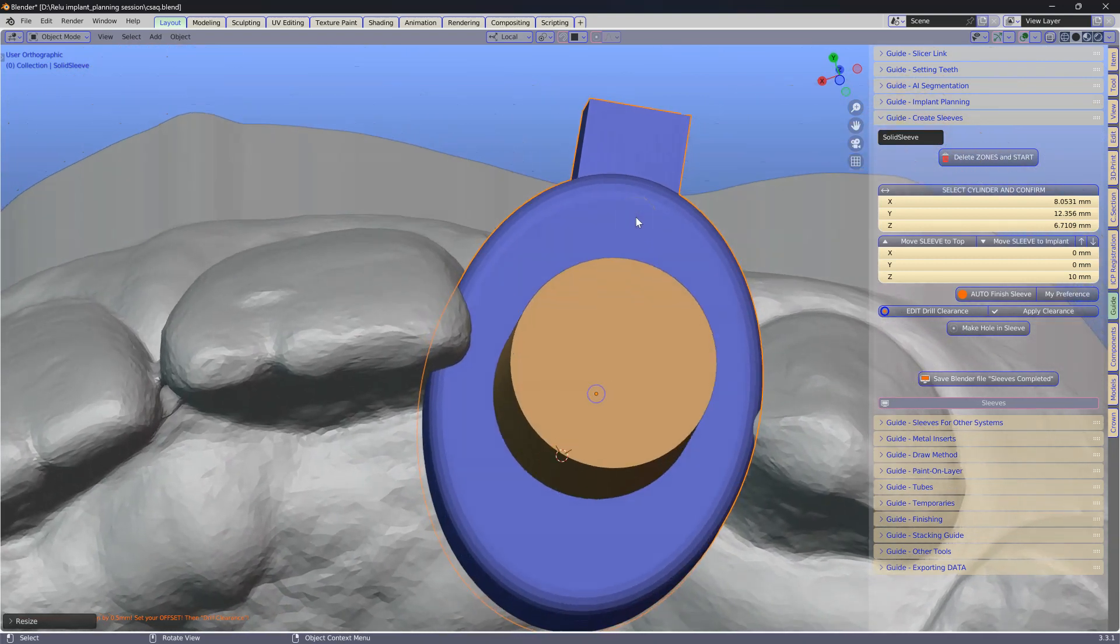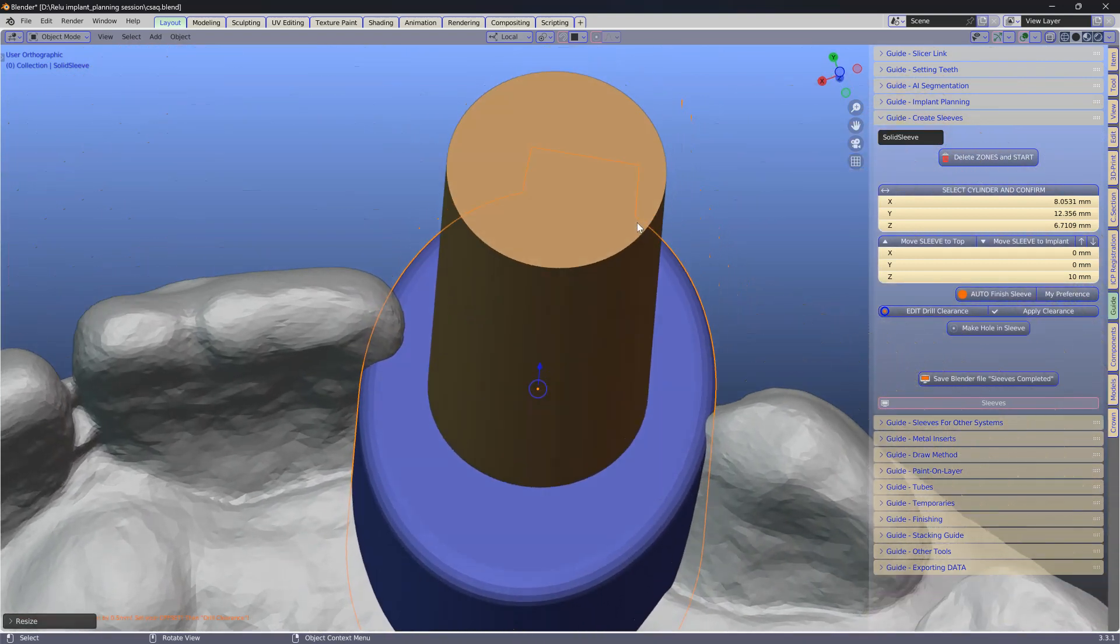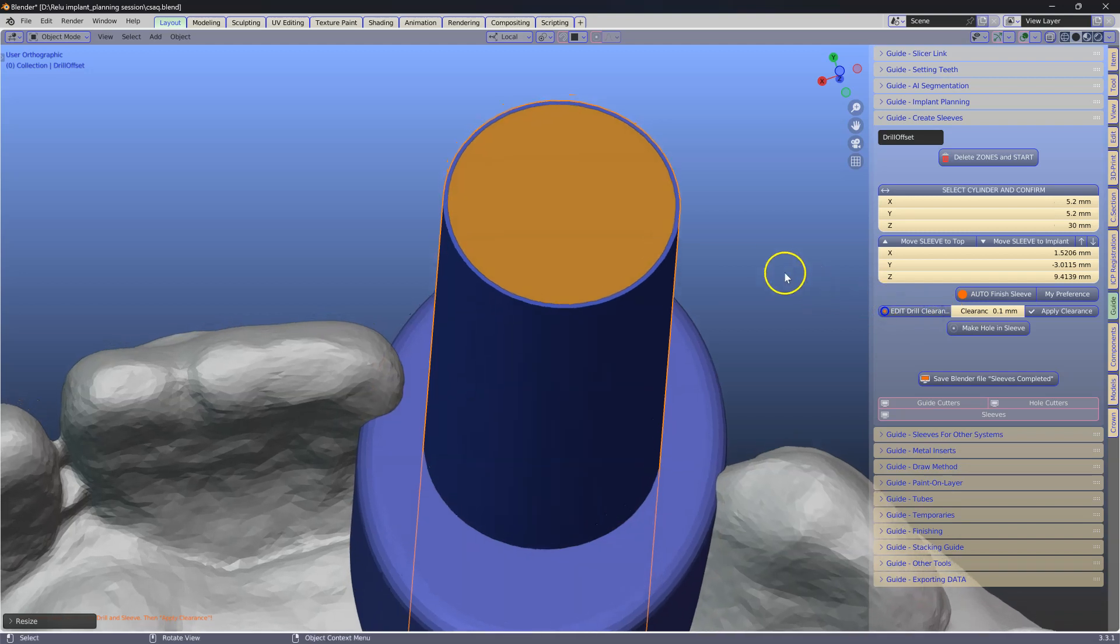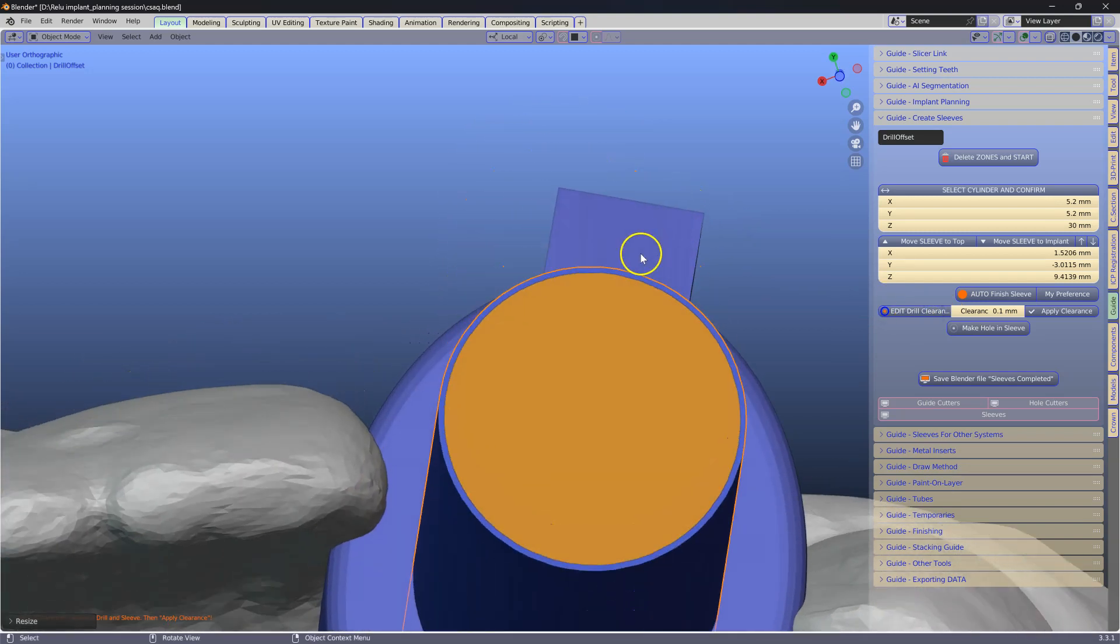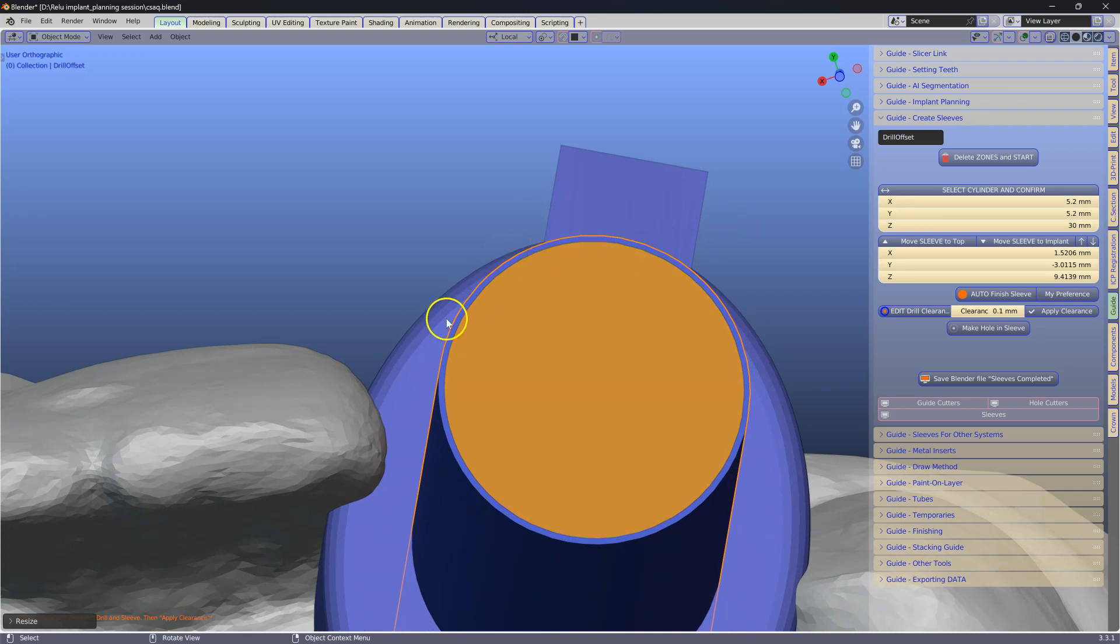After that we are going to focus on making the hole. Click Edit Drill Clearance. This is going to give us 0.1 clearance around this cylinder.